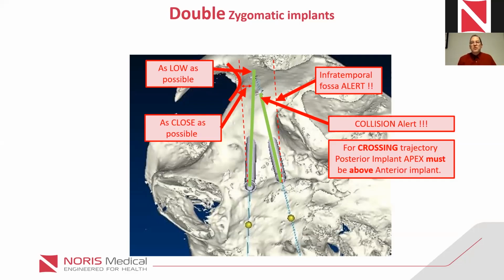It's the same thing with the implants. If you take one implant, it will bend. I mean, it's a Zygoma, it might bend, you're putting a lot of forces on the bone, but if you close it in a construction, it works completely different. When in a construction, there is no torque, there's no moment on the bone, it's only forces, okay?